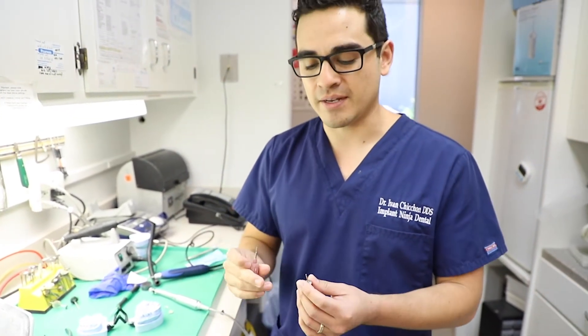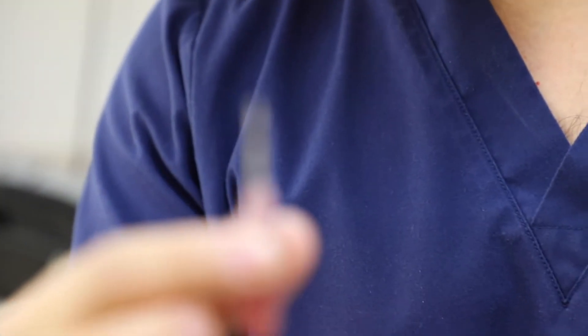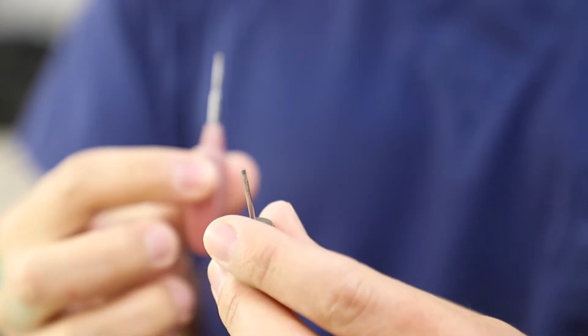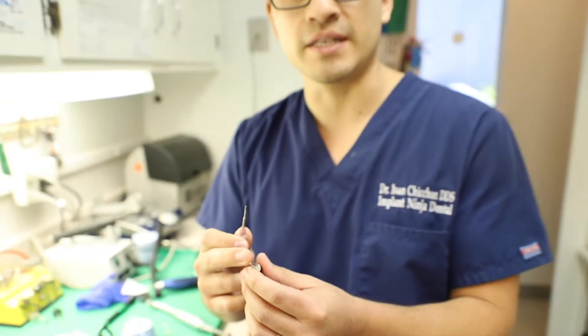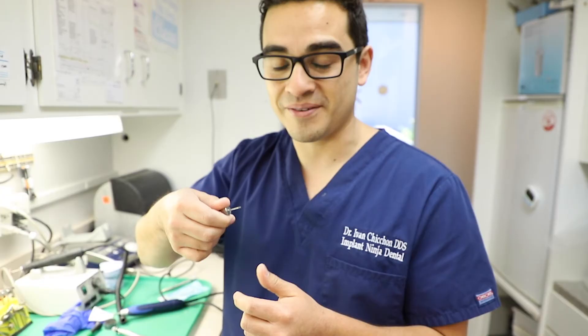The first thing you got to do is get your loops, get your light. So if you're trying to insert it with one driver, try switching out for another driver. If you know that the screw is stripped for sure, you might as well try out different drivers and see if they pull the screw out. Try even pushing down really hard and twisting to unscrew it.